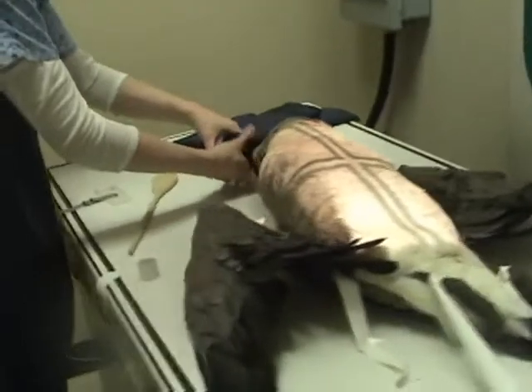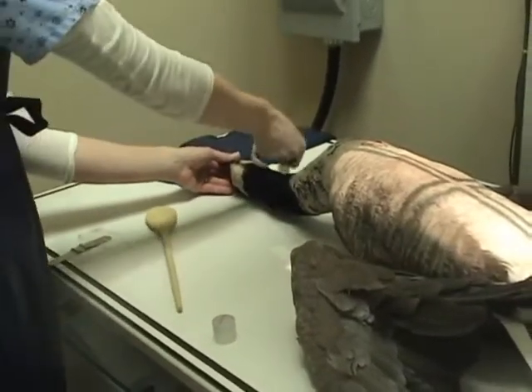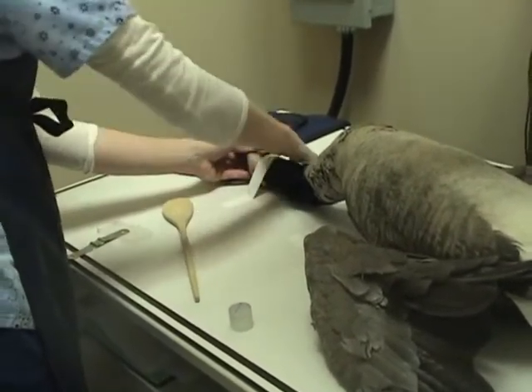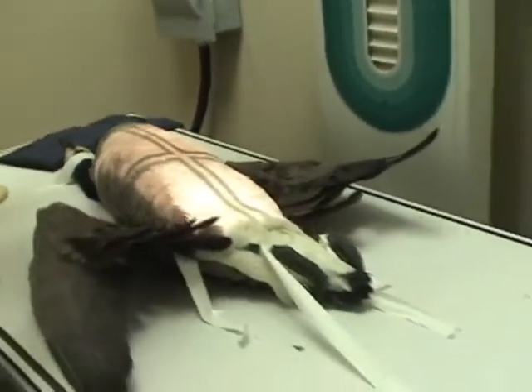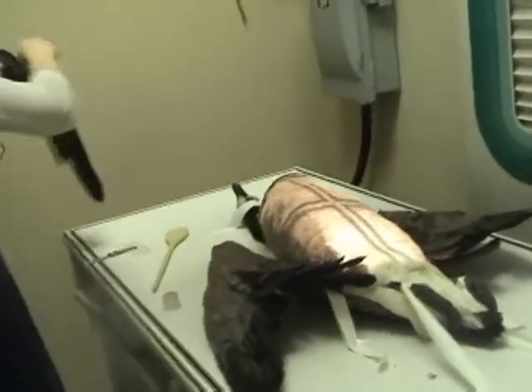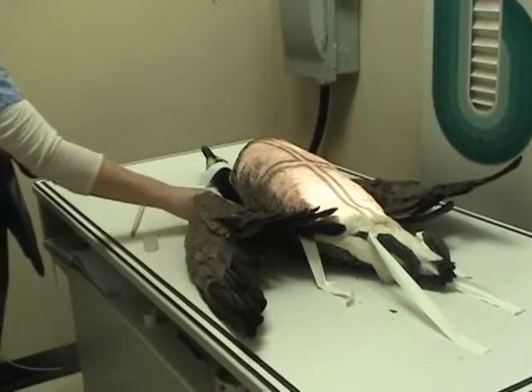The neck is gently extended in a cranial direction and is also secured with tape. This was a pretty large bird, so I was not able to collimate much past what you see here. You'll want to make sure that the center of the beam is centered midline at the caudal tip of the sternum.